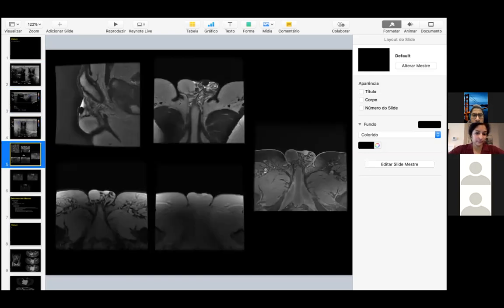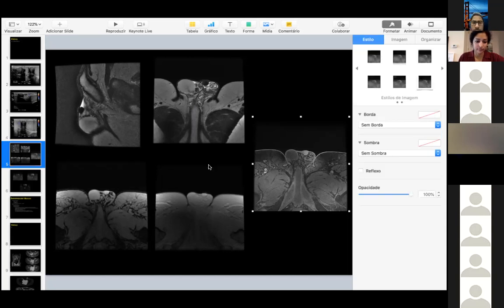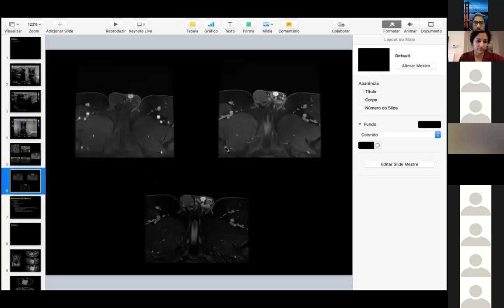So top images on the left side, you have the T2. And so this is the abnormality. It's profoundly T2 hypointense. Again, it's separate from the actual testicle. You can see there's a little hydrocele with that. I'll show you also the in and out of phase at the bottom. I can see that it does not contain fat. And then on the right-hand side, this is the T1 pre. And here, this is the postgadolinium sequences. You can see that it's avidly enhancing.